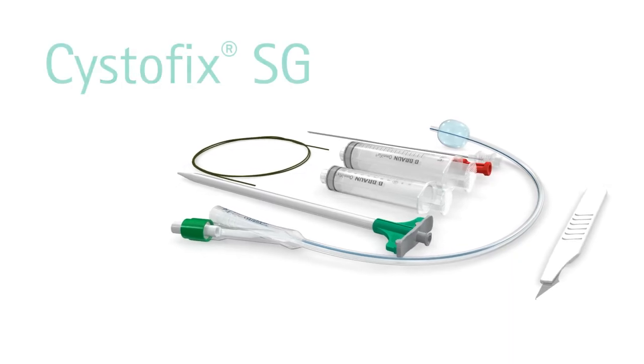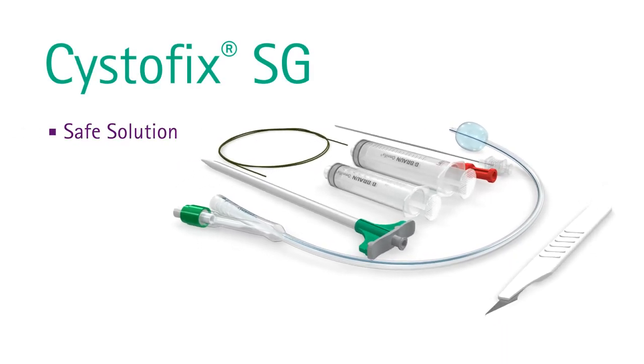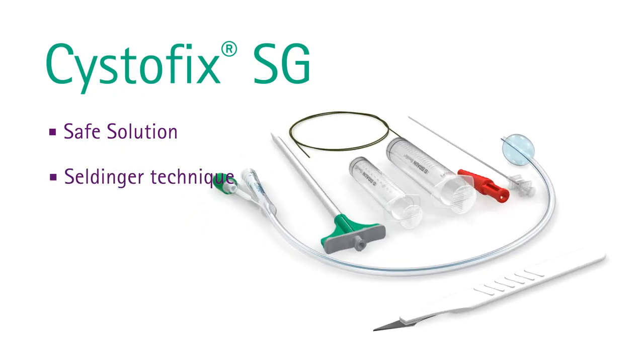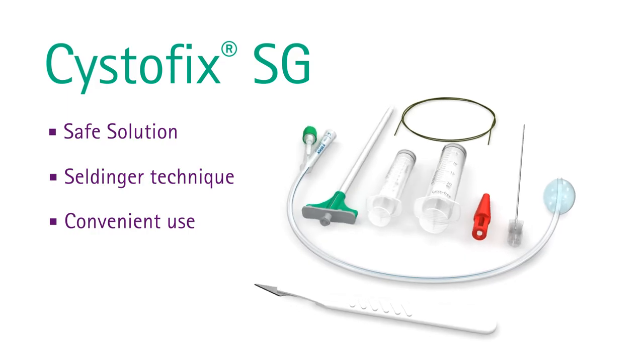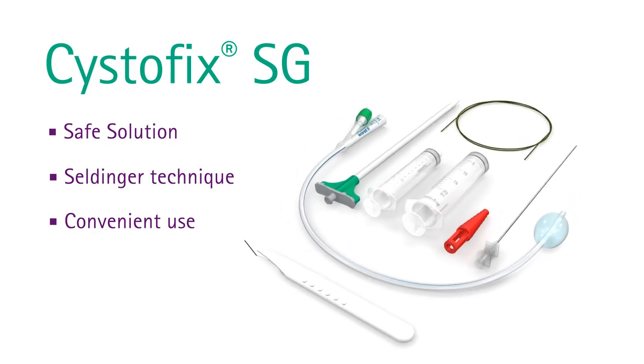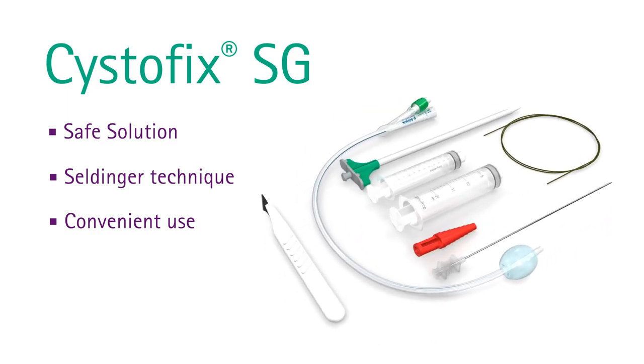In conclusion, the new Systofix SG set provides a safe solution for suprapubic catheter insertion with a technique that is already familiar: the Seldinger technique. It is available in different sizes and all the components are included.